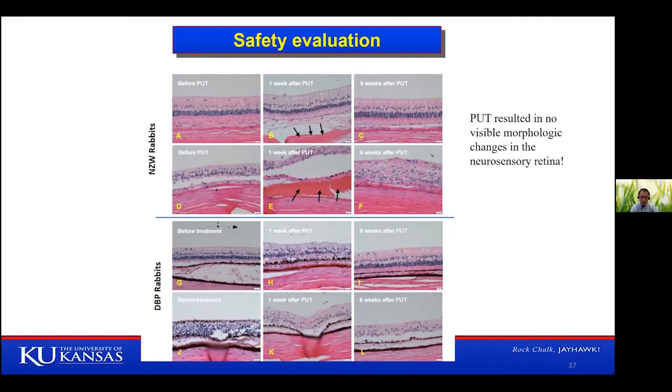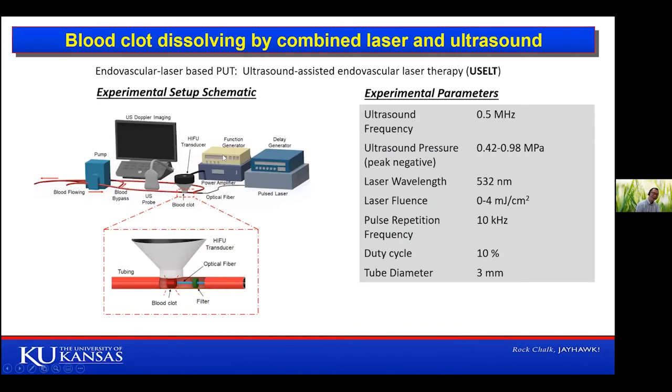Okay, I think my time is running short. The other project I've been working on uses the same technology, combining laser and ultrasound to dissolve blood clots. With this technology, we gave it a new name. It's called ultrasound assisted endovascular laser therapy, which is basically endovascular laser-based.